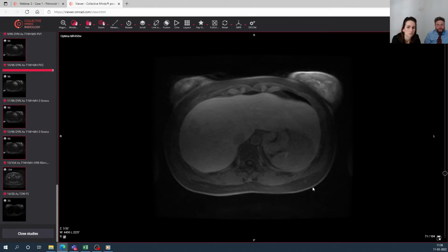Yes. But we want to prevent doing a biopsy, because if it's an adenoma, we have risk of bleeding. FNH also. You have about 1 to 2% you can have excessive bleeding after biopsy. But what did we do in this situation? So it's an older case. I think we need an MRI with Primovist. Okay, we gave also Primovist in a second time.